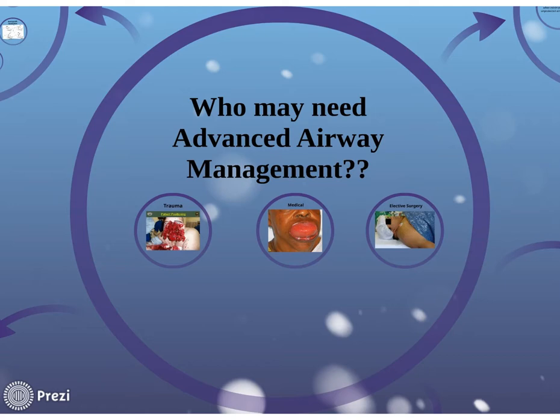When a person has the no neck, you know, big, thick neck, no neck, what's this distance called between here and here? Okay, so if they have like one finger breadth, I think an anterior airway is going to be challenging. Now, even the GlideScope and the McGrath, all those handy-dandy tools may or may not help us with that. So you may have to have other things ready.